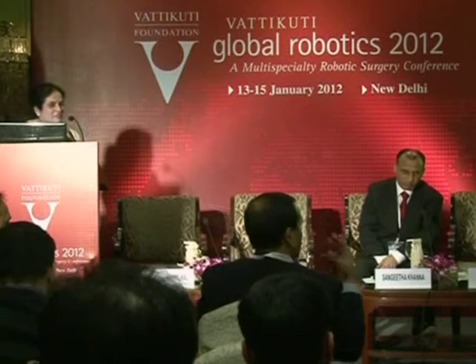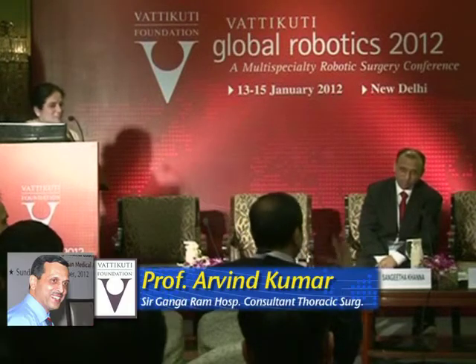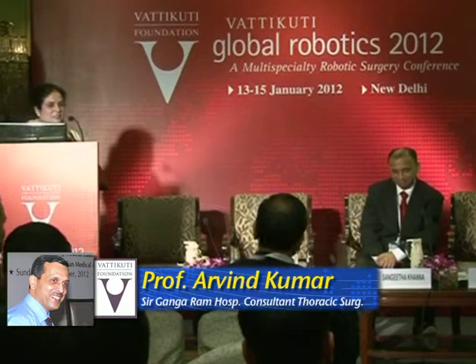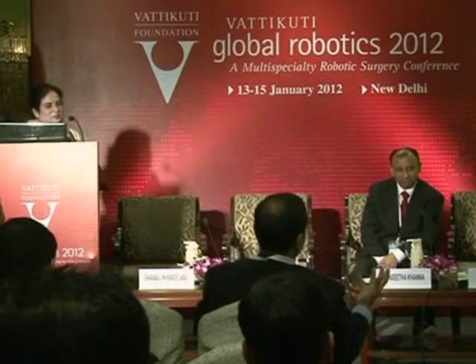But the thing is that the success of thoracoscopy or robotic surgery depends on achievement of one lung ventilation. If the tube is not placed, in thoracotomy you can still operate on a ventilating lung, but in thoracoscopy or robotic surgery you just cannot enter a ventilating lung.